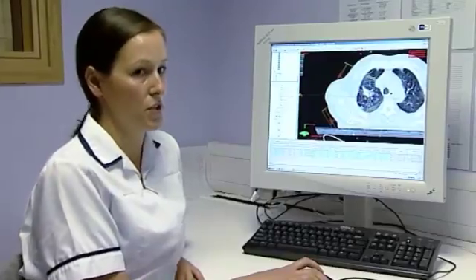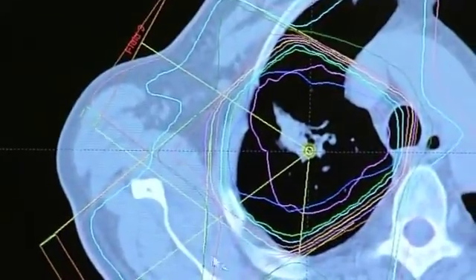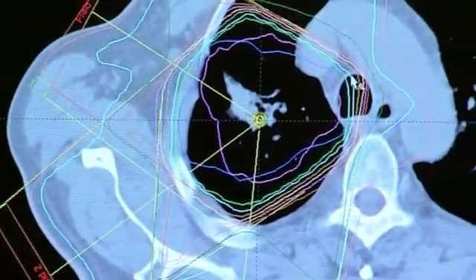We applied wedges to these beams and these helped us push the dose from this hot area here over to this cold area here.